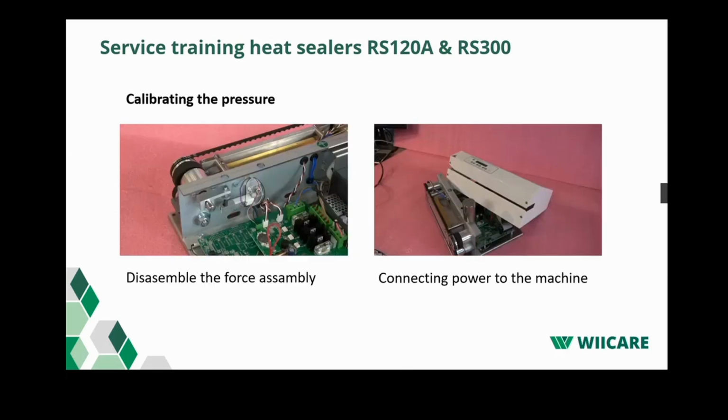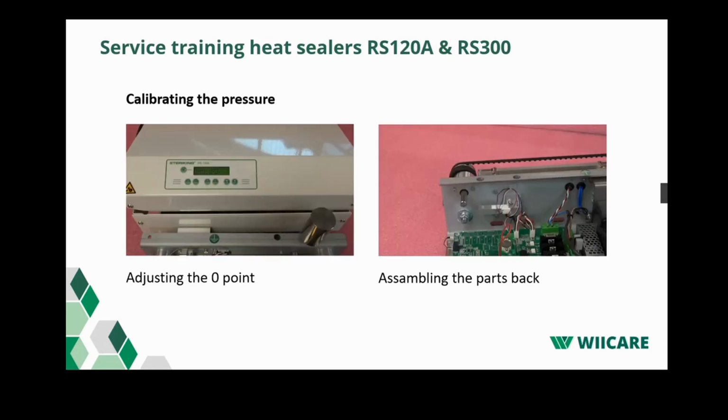Let's have a look. So here we get the video how to adjust the 0 point. And as I said, this is normally done when you receive a new PCB board or when you replace the pressure sensor. To enter the menu to calibrate the force, press the on button. Now we need to adjust the value of force 0 until the value of the force is 100. You do this by count plus and count minus.